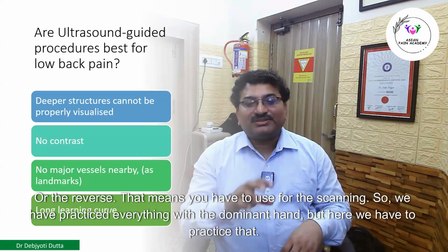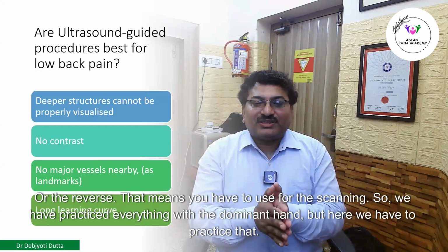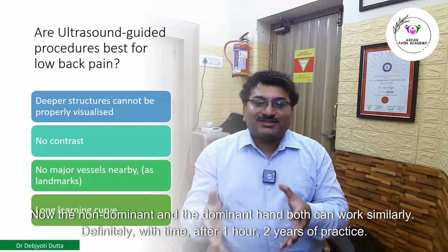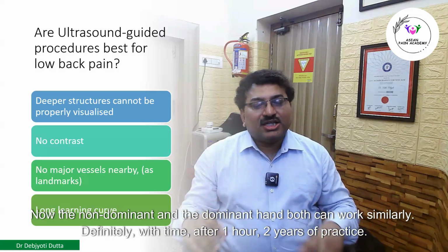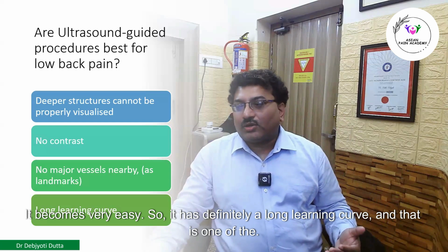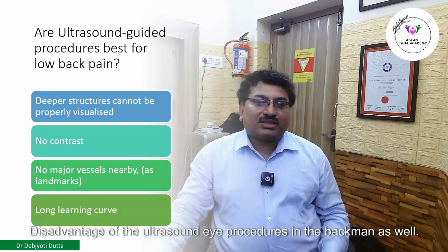So we have practiced everything with the dominant hand, but here we have to practice so that the non-dominant and the dominant hand both can work similarly. Definitely with time, after 1 or 2 years of practice, it becomes very easy. So it has definitely a long learning curve, and that is one of the disadvantages of ultrasound guided procedures in back pain as well.